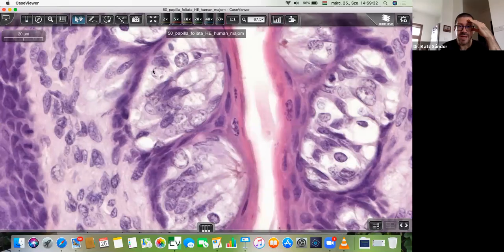The big nuclei belong to the sensory cells, which are modified neuroepithelial cells. The slender, flattened nuclei belong to the supporting cells among the sensory cells. At the bottom of the taste buds we find basal cells. They are stem cells that differentiate into either supporting or sensory cells.